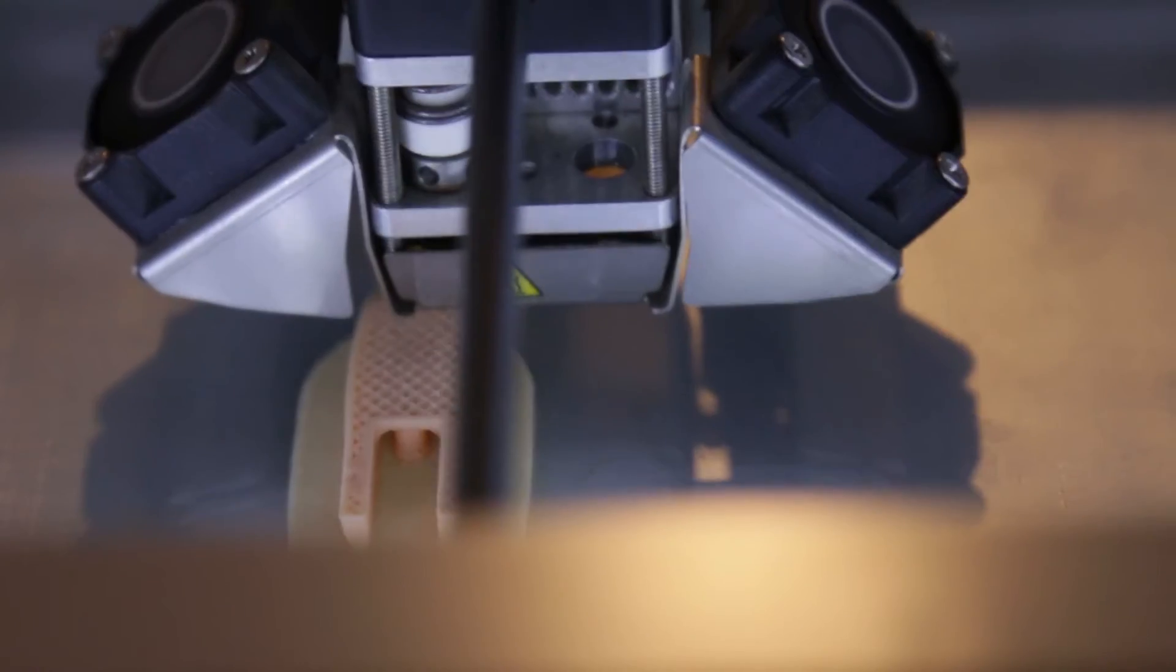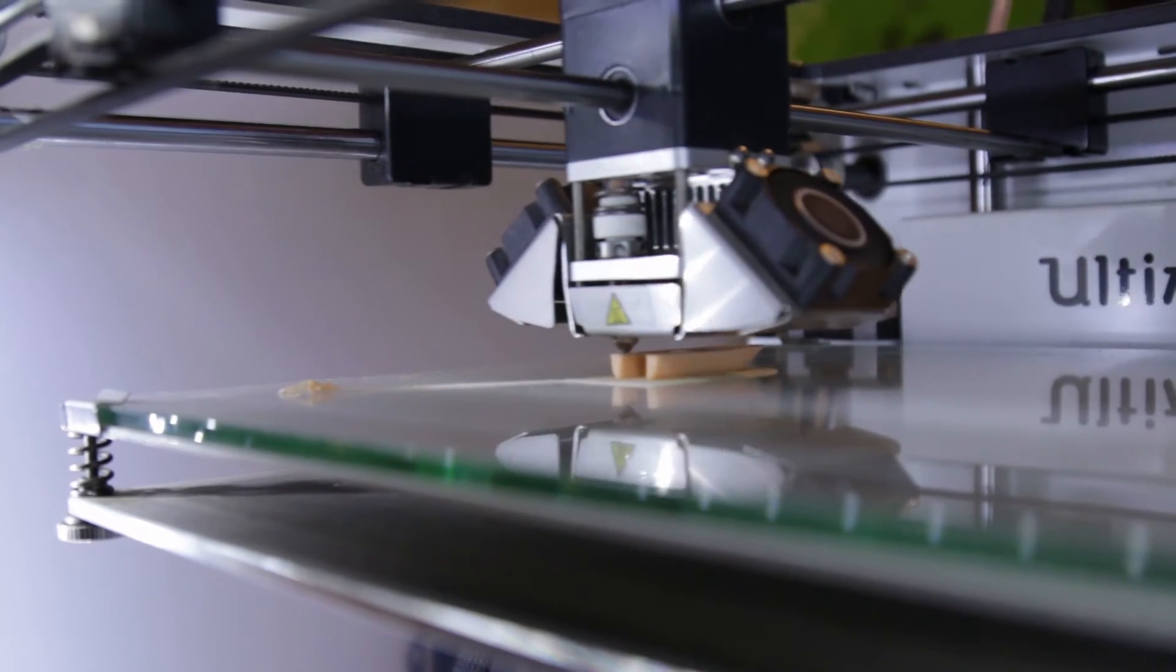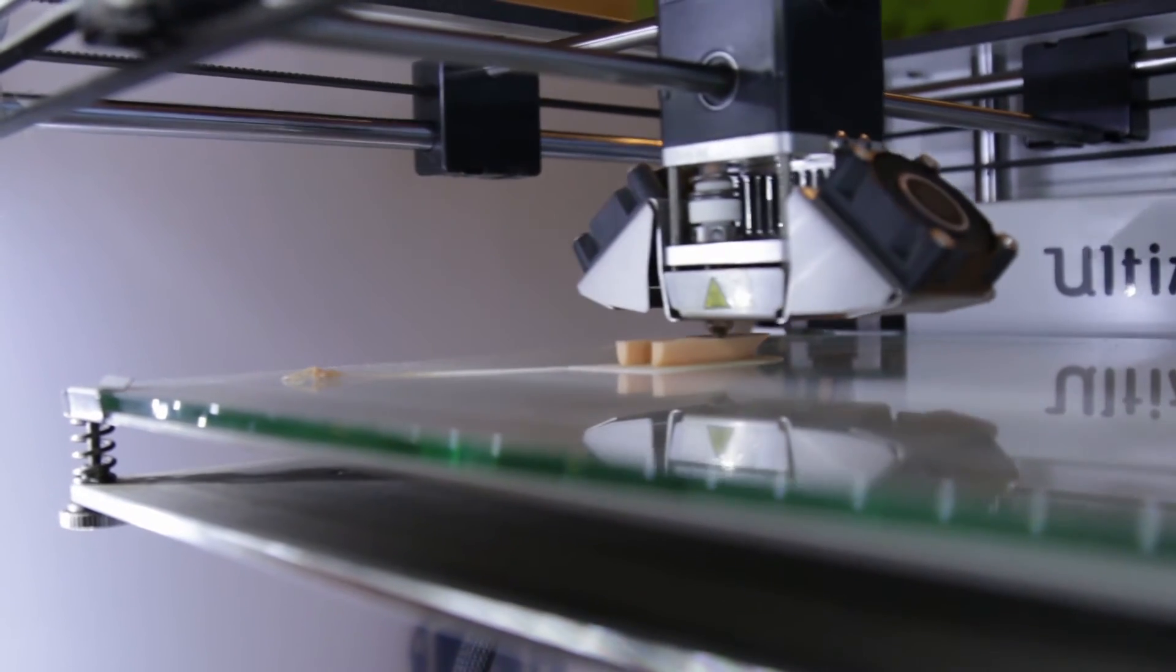Our 3D printed hand provides functionality to the patient. It is lighter in weight and the patient can do his daily life work normally.